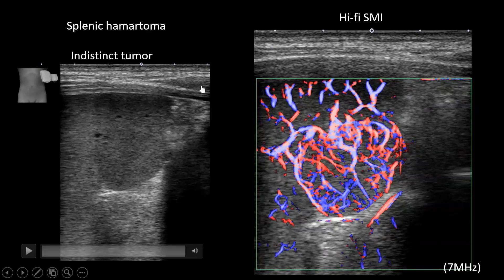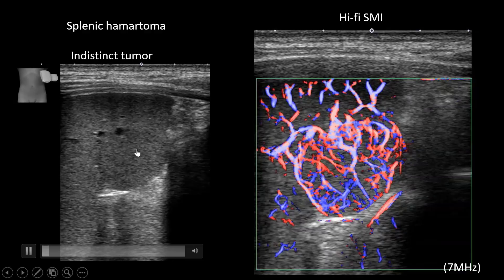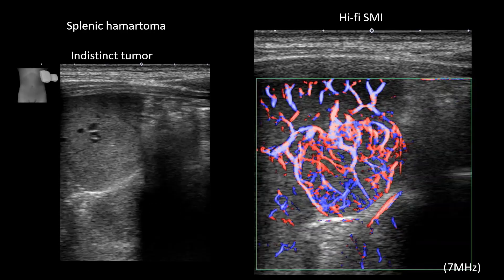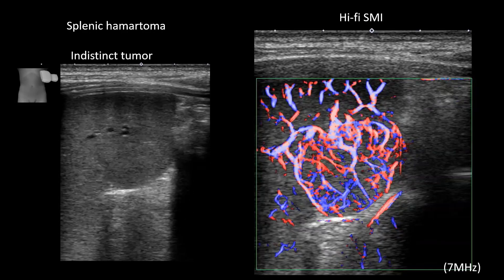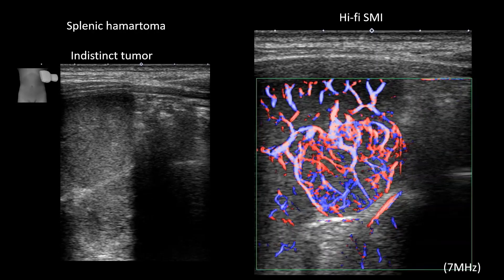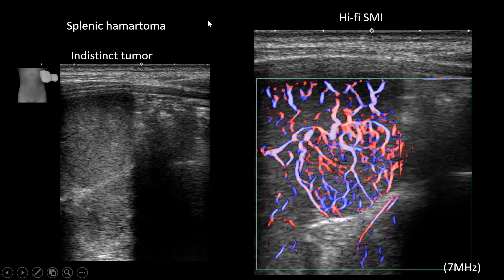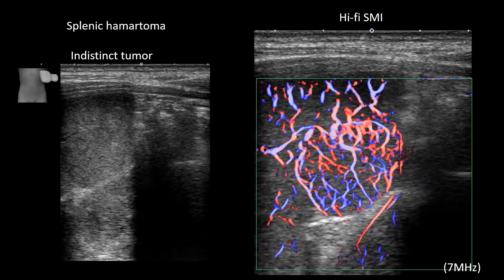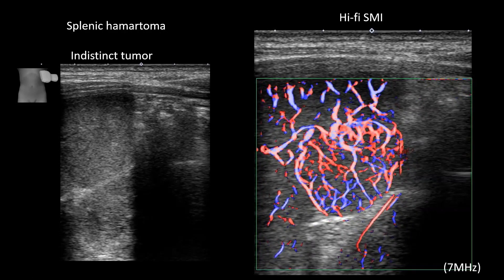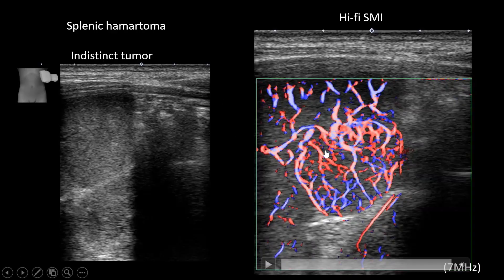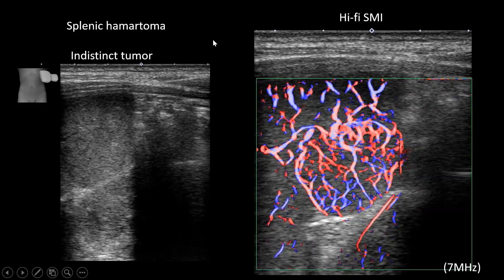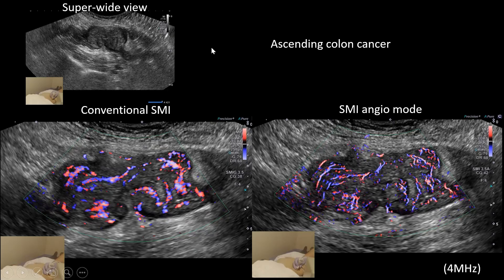This is a case of splenic hamartoma. On grayscale you can't be really sure if there's a tumor — the border is somewhat blurred and indistinct. But by using Hi-Fi SMI it shows a rich vascular structure that appears centripetal, and you can be sure this is a tumor.